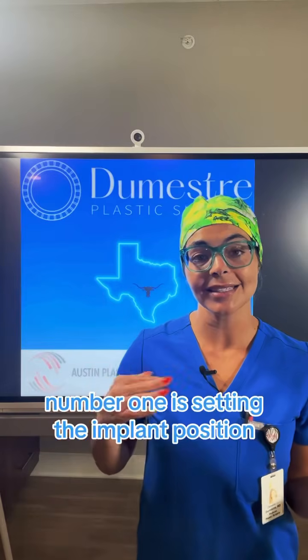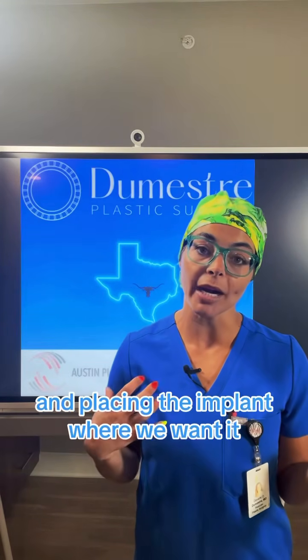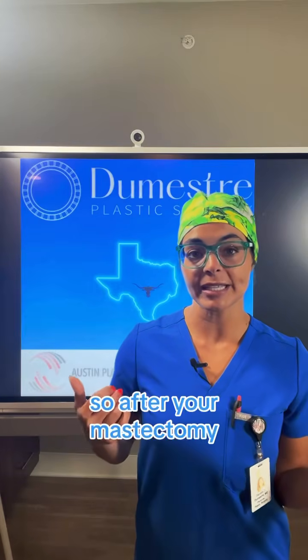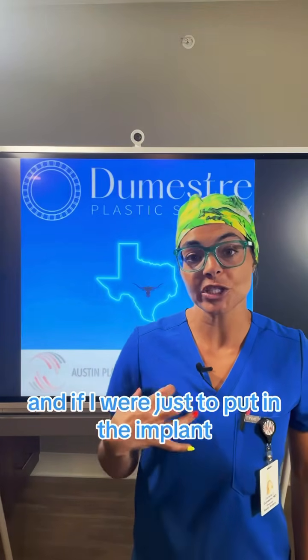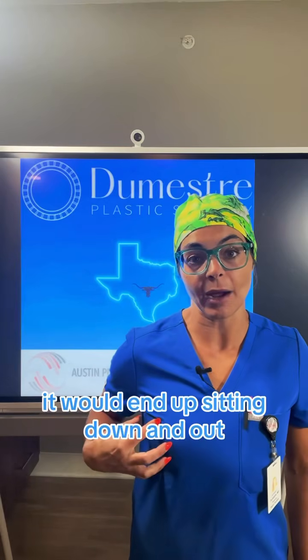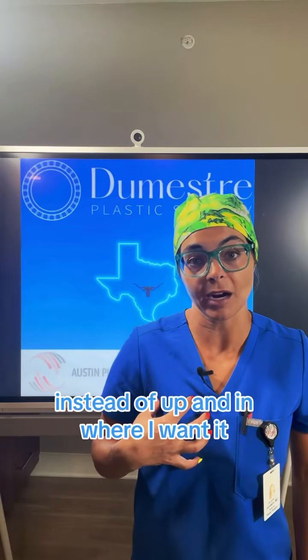Number one is setting the implant position and placing the implant where we want it on the chest wall. So after your mastectomy, you actually have a pretty big hole, and if I were just to put in the implant, it would end up sitting down and out instead of up and in where I want it.